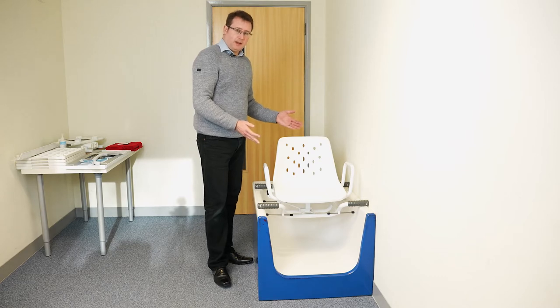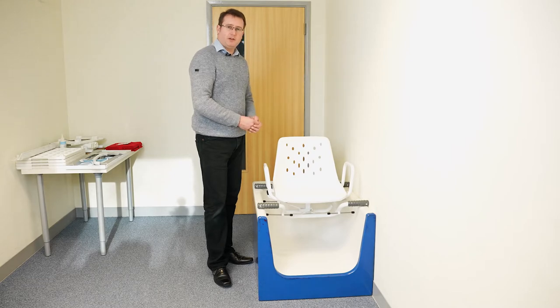I'm going to show you how to fit it correctly, make sure it's adjusted to suit your client, and give you some tips and information as we go along.